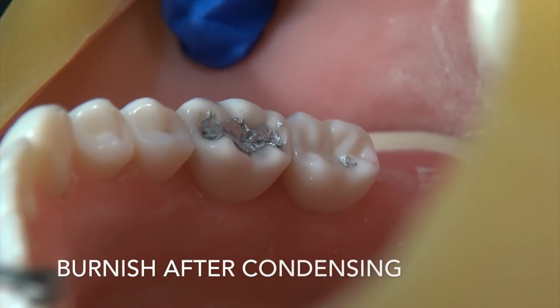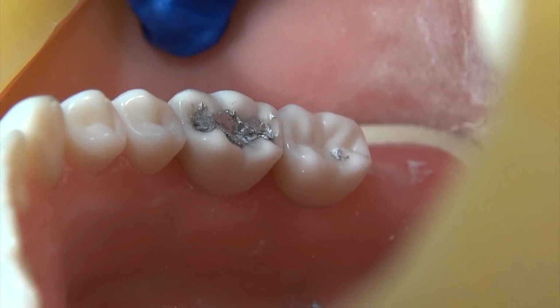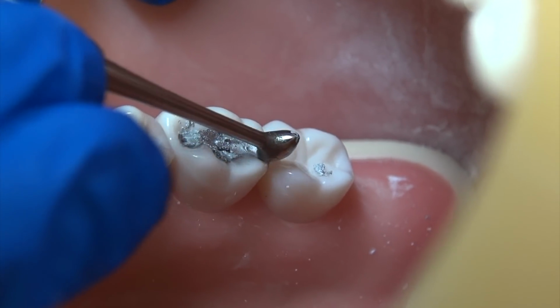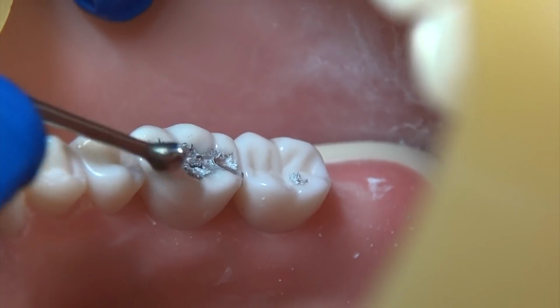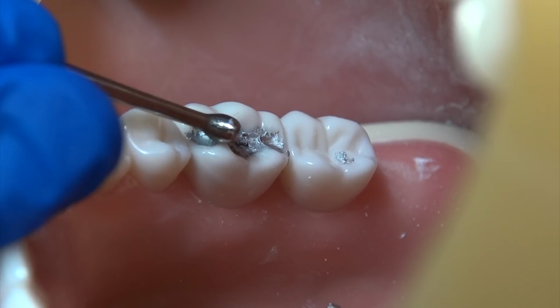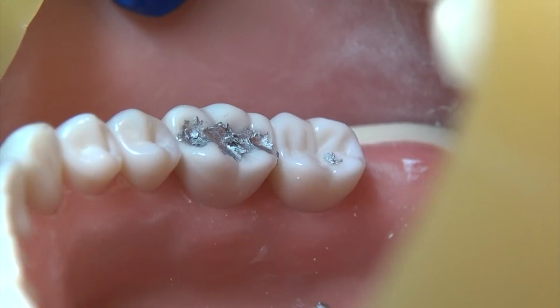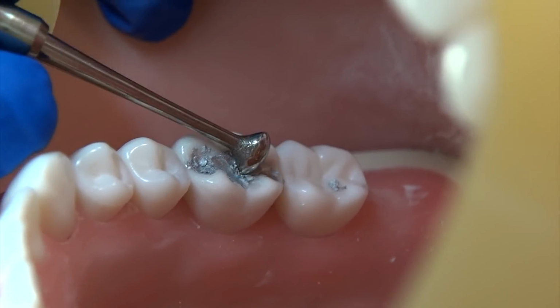Okay, now this is where we bring in our burnishers. So this is the beaver tail. I really like this one for creating that anatomy. You can really go into the fossas really nicely with this, really tracing that natural anatomy. And it's really important that you're going from the original tooth structure and following those grooves and then going into the central groove. So from the buccal, coming down.